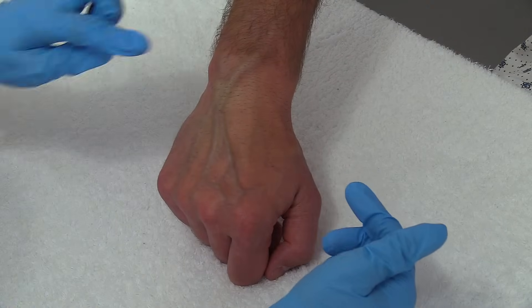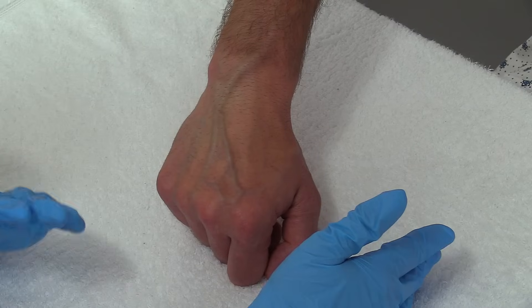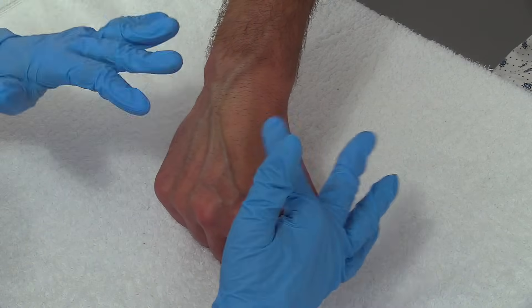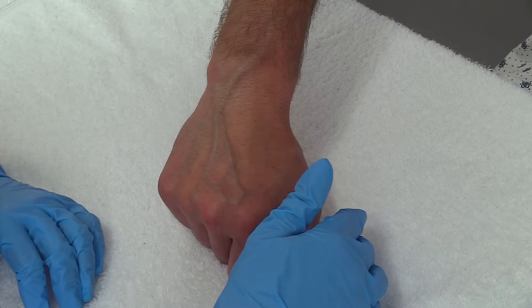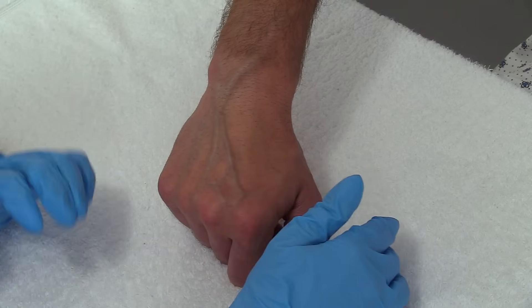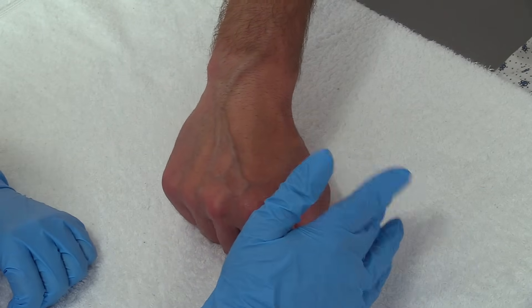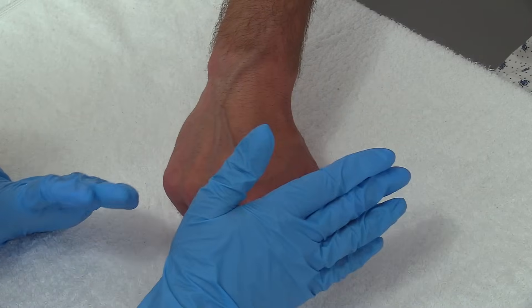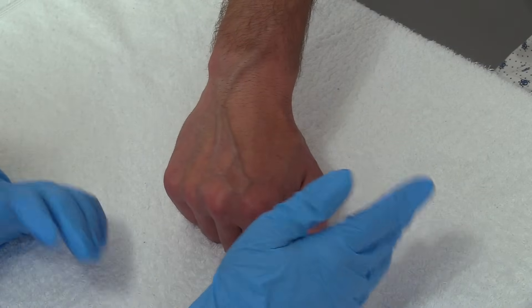Here we have actually trimmed the patient's hair, and sometimes you have to do this because whenever you go to secure it the tape will not stick to the patient — it'll roll off over time. Plus whenever you go to remove the IV it'll be very painful to that person who has a lot of hair. We have used trimmers that have just trimmed it; you don't ever want to use a straight razor, so use whatever trimming supplies your facility has.